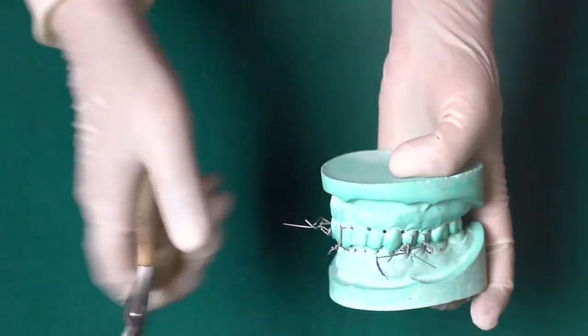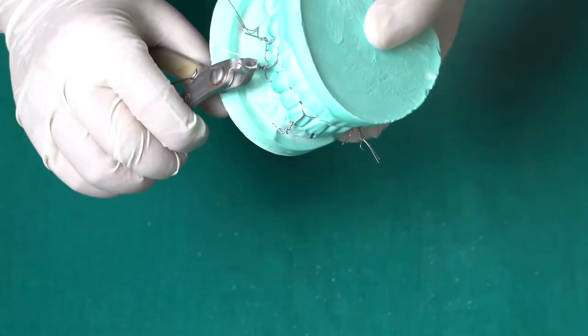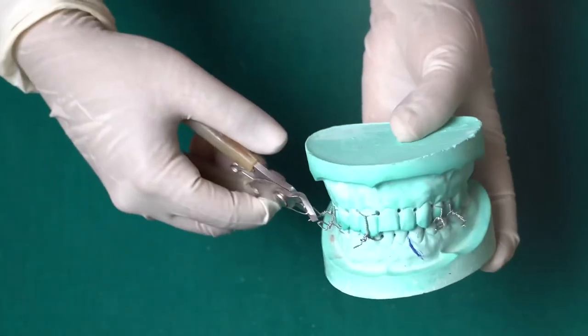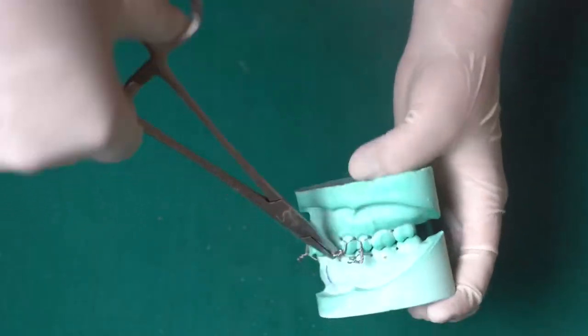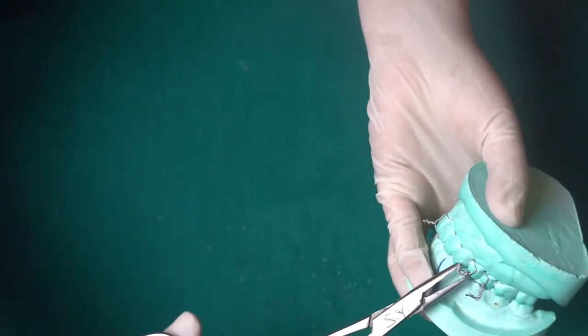Now we will twist all the mandibular wires together tightly with their corresponding maxillary wires. Then cut short all the tightly twisted wires, and twist and tuck them in so that they do not impinge on the oral mucosa.